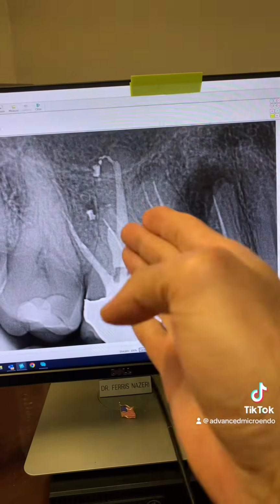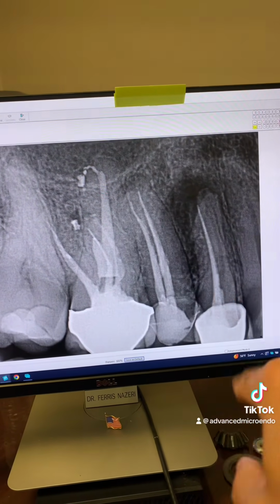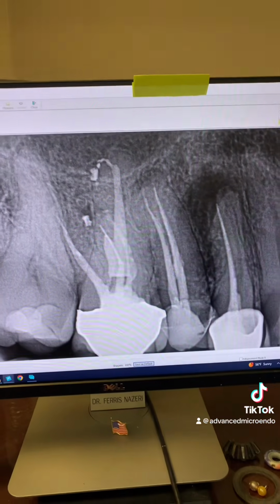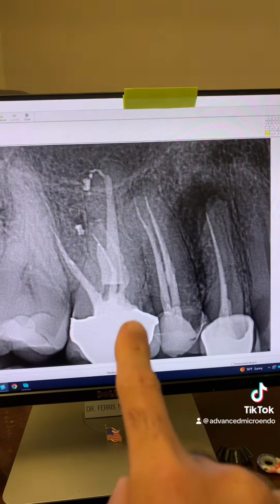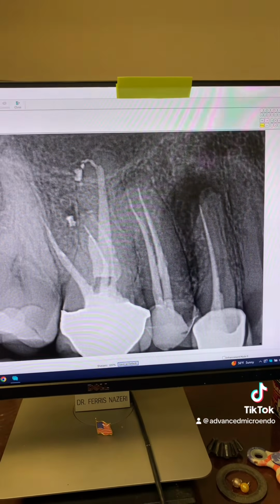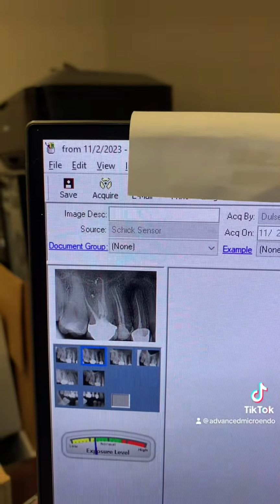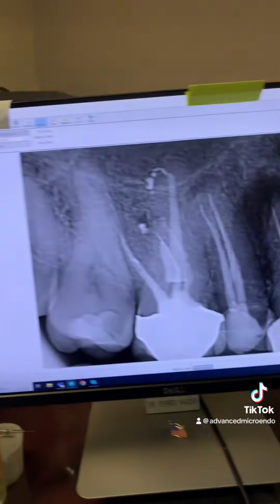And this was just a few days ago when he came in finally for me to redo the root canal on tooth number 5. And take a look here, tooth number 3. So this would be almost 2 years post-op of tooth number 3. The patient had 0 symptoms, the tooth was in full function, but the patient still had the Cavit from 2 years ago. He hadn't gone to the dentist to have tooth number 3 restored permanently, so the Cavit was still in tooth number 3. And this is the date, the day I saw him, almost 2 years post-op.